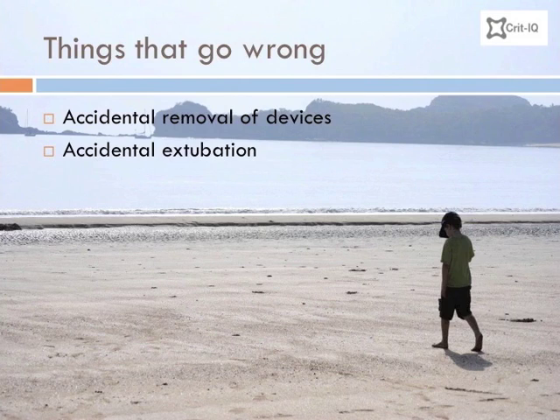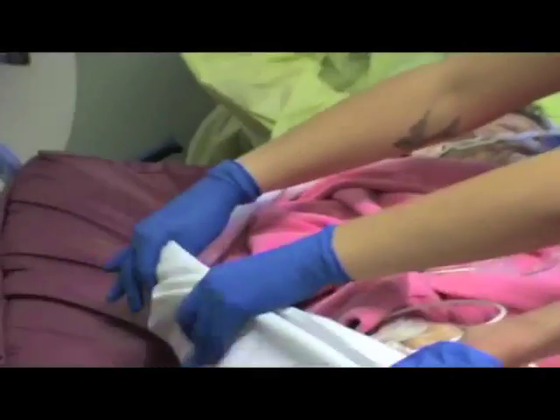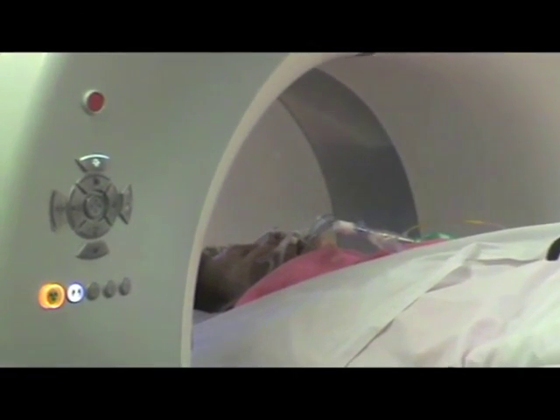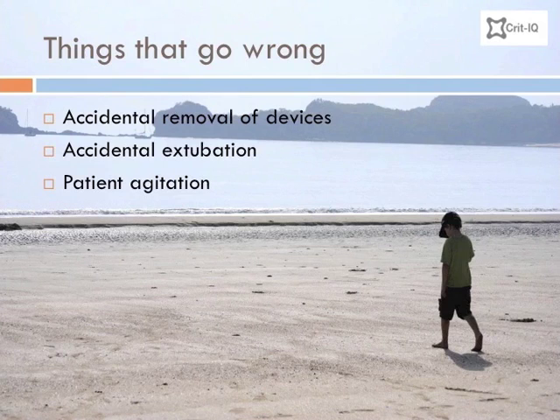In addition to extubation, the tube itself may obstruct because of sputum retention and of biting of the tube. Patients may be quite settled in the intensive care environment, only to become very agitated during transit. This can be precipitated by movement, painful body parts being touched or bumped, or simply because they are confused by the new environment. Agitation can be dangerous, as it leads to dislodgement of tubing, falls, or even staff injury.